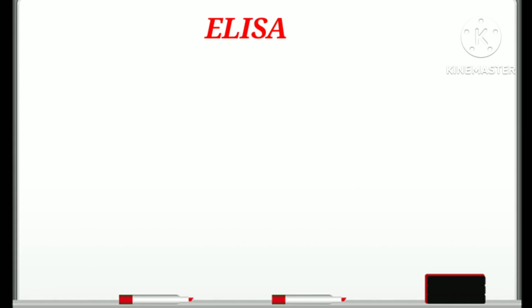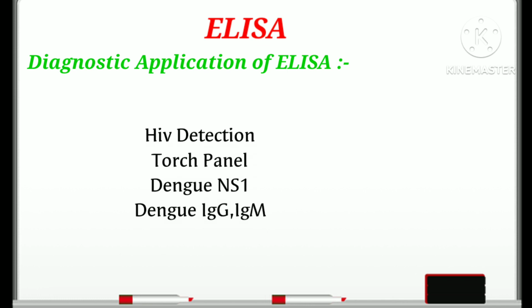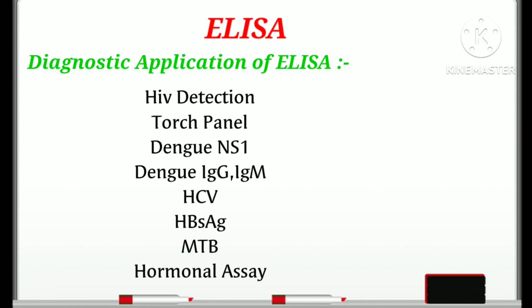Coming to the next point, diagnostic applications or uses of ELISA. HIV detection, TORCH panel, dengue NS1, dengue antibodies IgG and IgM, HBsAg detection, HCV detection, Mycobacterium tuberculosis detection, and differential hormonal assay in the laboratory.